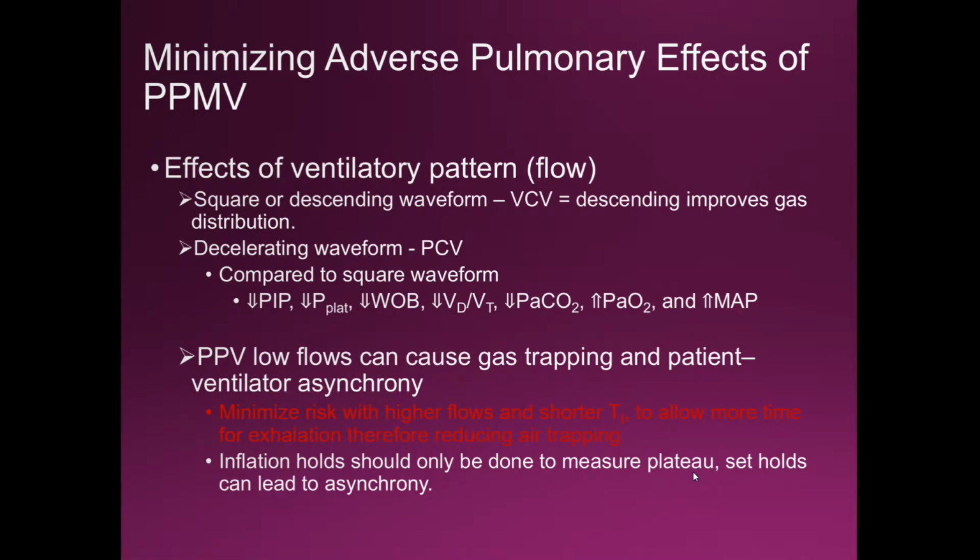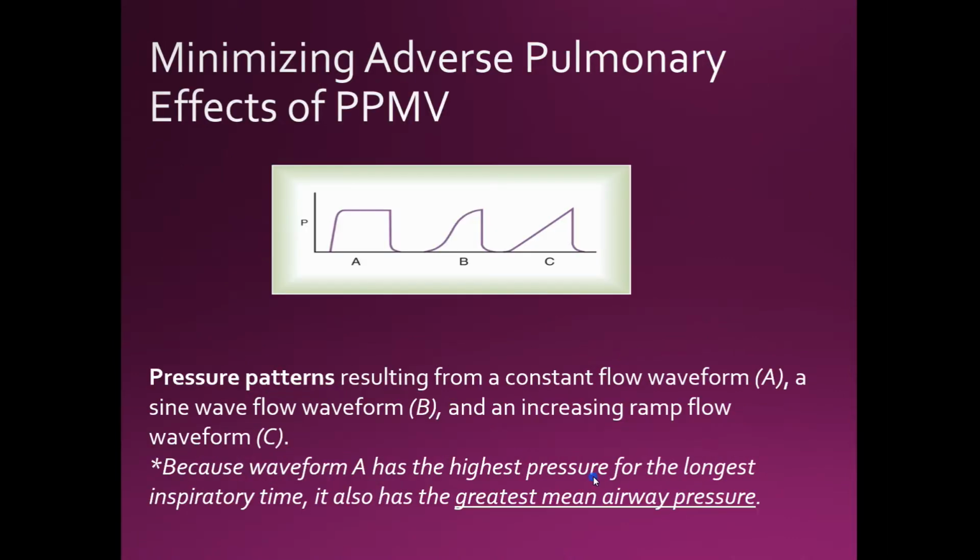For example, on the Draeger, you can press and hold that inspiratory hold button as long as you want. Actually, you have about 7 seconds until the machine will kick in. That's a long time to have your breath on hold. So for the Draegers, you want to hold it for roughly 3 seconds. But for the PB840, you just press the button and it will calculate your plateau pressure. So we've seen this again.